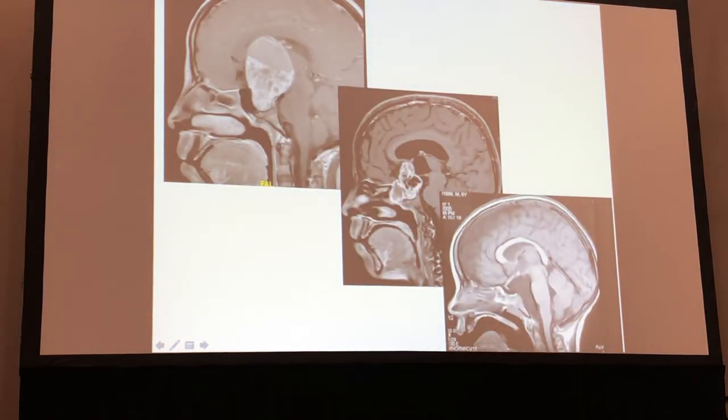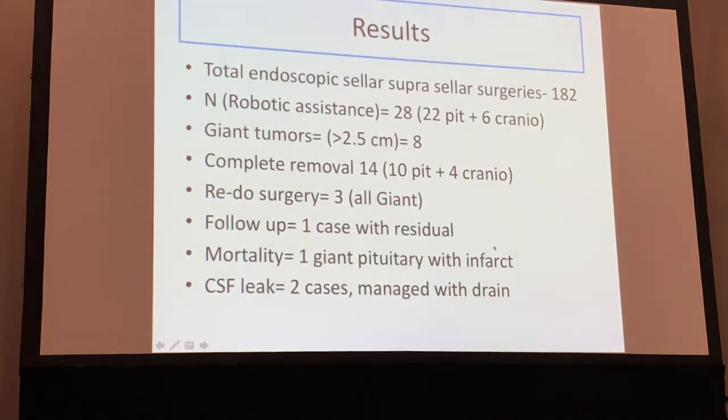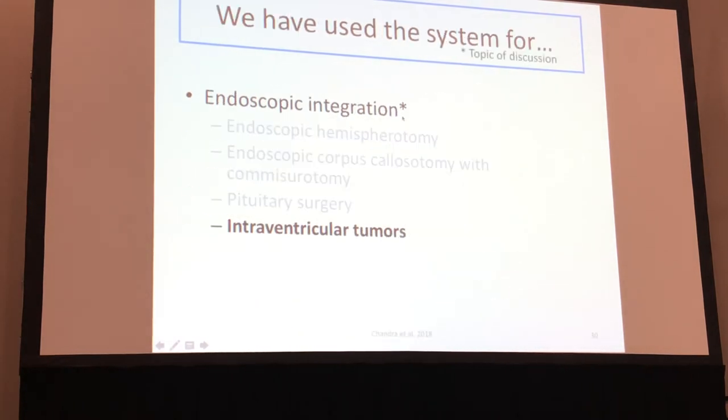invasive. So a few examples. This is a large craniopharyngioma which we did with robotic assistance. We have to phase it. So this is the second stage, and the third stage has been removed completely. Similarly, giant tumors, we had to stage it. I think sometimes it's better to stage it. And our experience of robotic assistance for pituitaries has been about 28 cases.